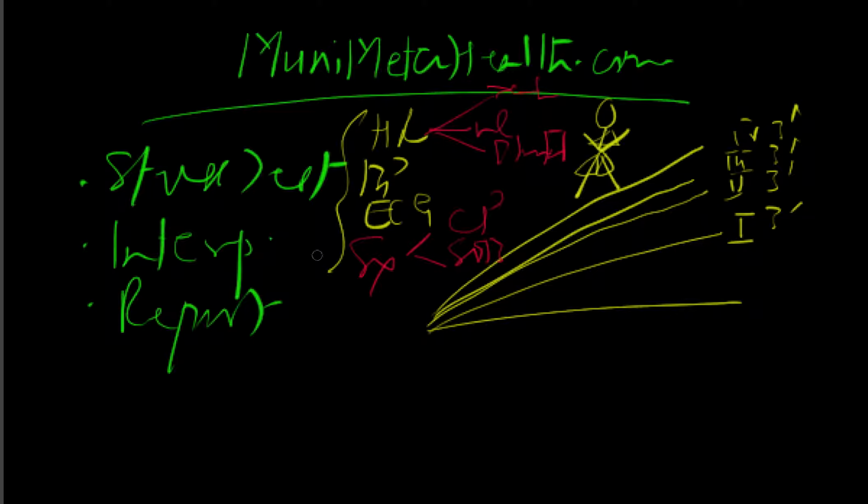So the symptoms may be the reason why the test could be limited. ECG changes could be the reason why the test is limited or stopped, terminated rather, I hate using that word. Blood pressure response, that could be again a normal response. It could be an exaggerated response, just like your heart rate, or it could be a blunted response. Now, blunted and exaggerated responses will also prohibit the test from going any further into the next stage. So you have to elicit all these things very carefully.